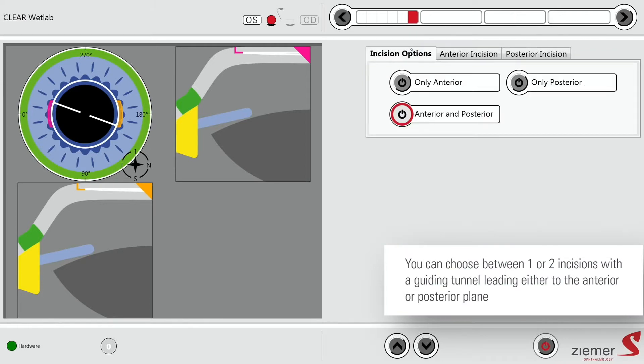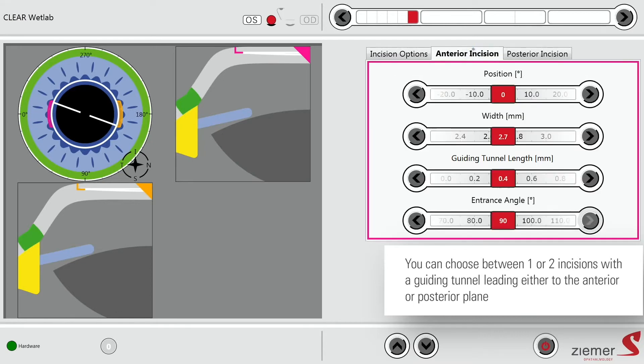We offer with the Z8 the option to have one or two incisions. If I choose one incision, I can decide to have it leading to the anterior plane or to the posterior plane. If I have the two, I will have then one incision for each plane. For each incision, I have some settings. I have selected a width of 2.7 mm and then a guiding tunnel length of 0.4 mm.